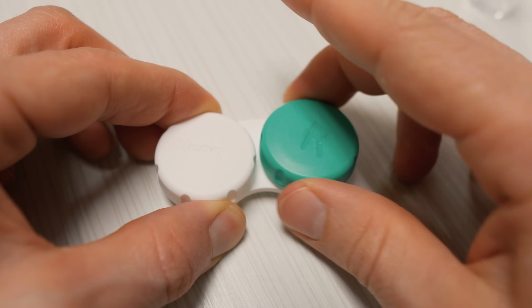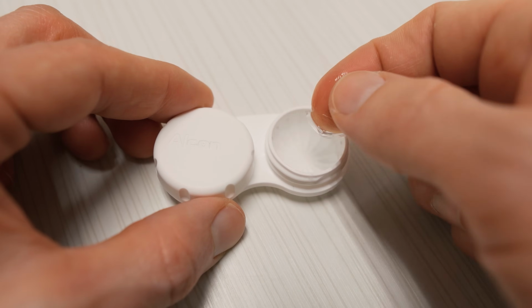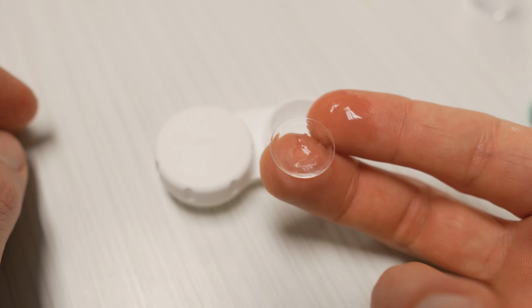Next, you want to identify which contact lens you're going to be putting in. I typically always start with my right eye because I am right-handed. That way I don't mix up which lens I'm putting in which eye. It's just easier to build a habit out of it. That way you don't have to try to remember which is which.